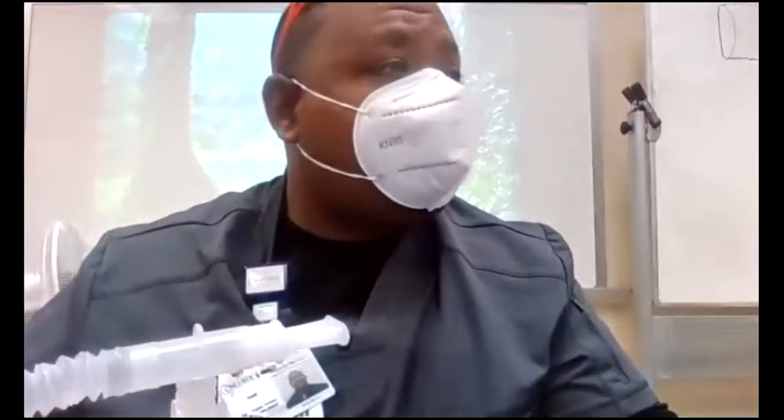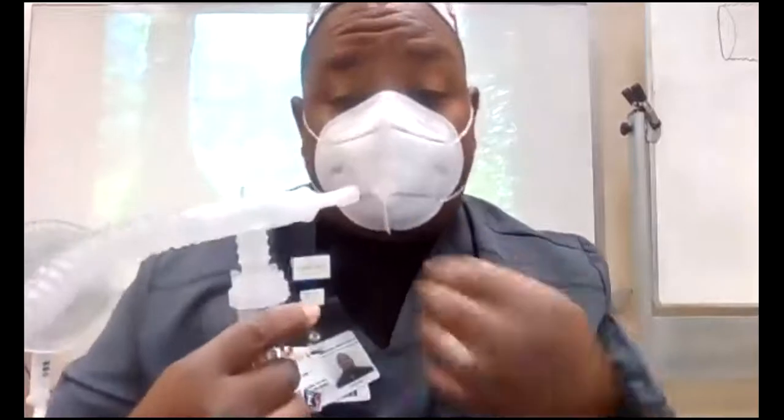Good, because if you've got a patient talking about, I can't breathe, and yelling and cussing at everybody else, you're breathing. Yeah, you're breathing fine, sir, right? You can tell when somebody really can't breathe, okay? But mentally, if they feel like they can't, give them a treatment. You know, they're paying for it, all right? But anyway, so I'm breathing. My regular ventilatory pattern will matter on how this is deposited, okay?